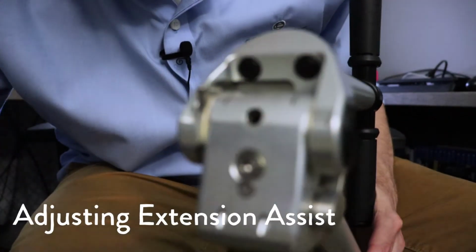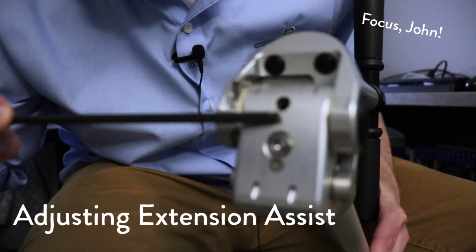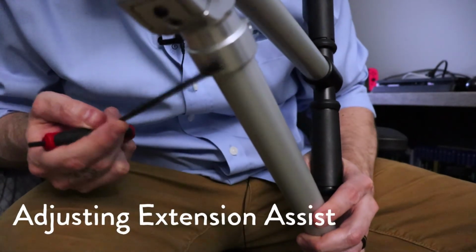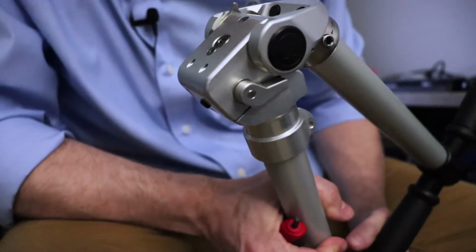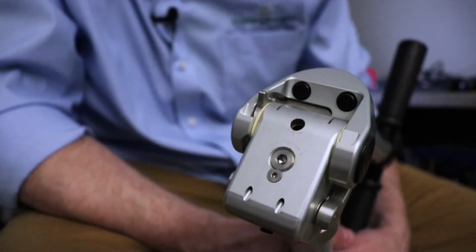So this right here is where our extension assist adjustment is. Normally this would be up through where the pylon goes on other knees. Ours is on the top here. Increasing that extension assist makes the knee extend more easily, faster.